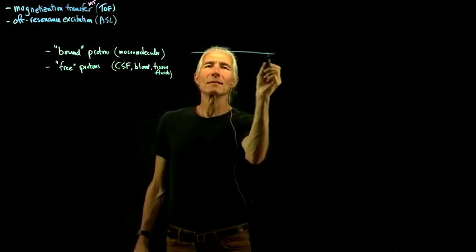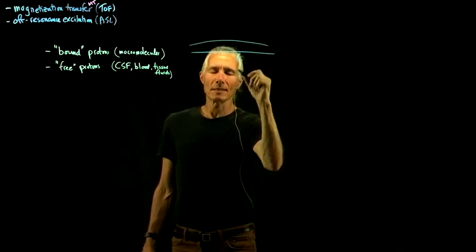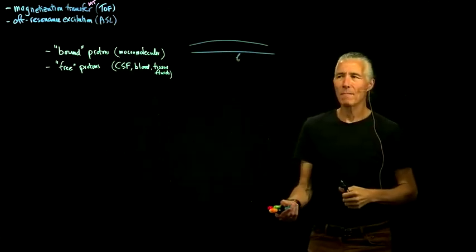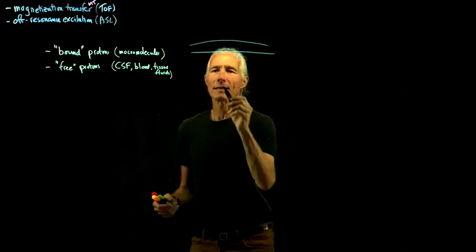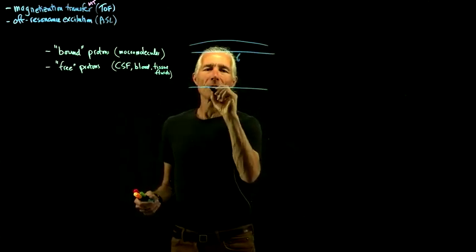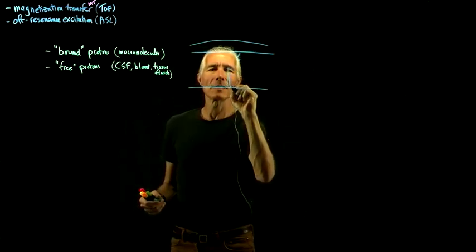The difference is you get this broad band of different frequencies. So if you just do an RF pulse containing all frequencies and then look at what resonant frequencies come back when you record it, you see a big broad peak like that. Whereas if you just do plain water, you'll get this extremely sharp peak, a little sharp peak like that.